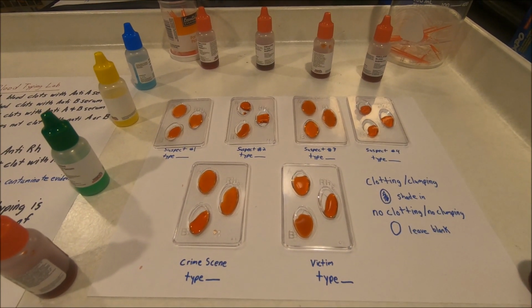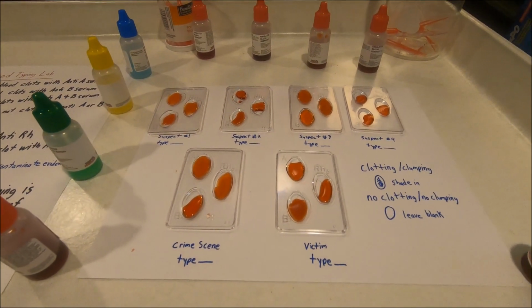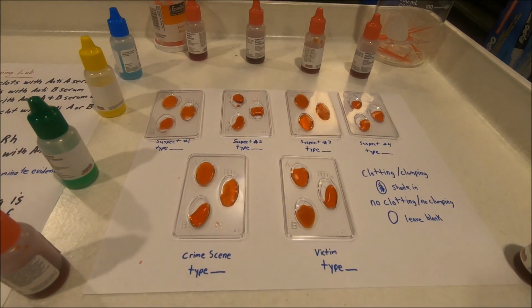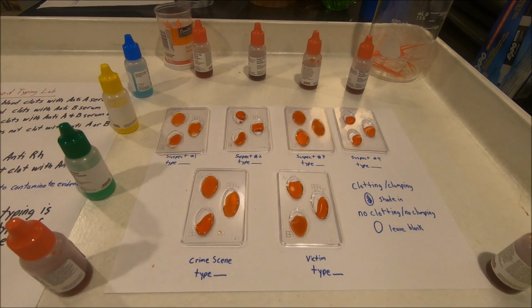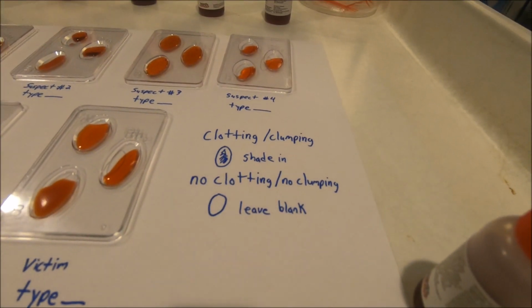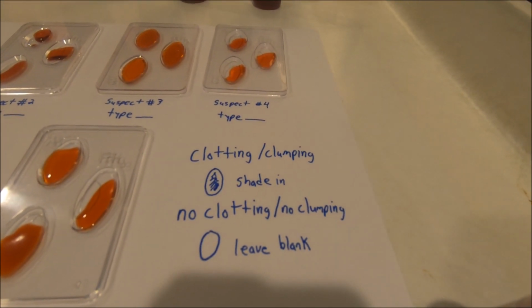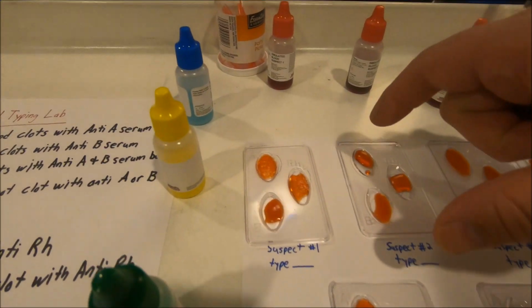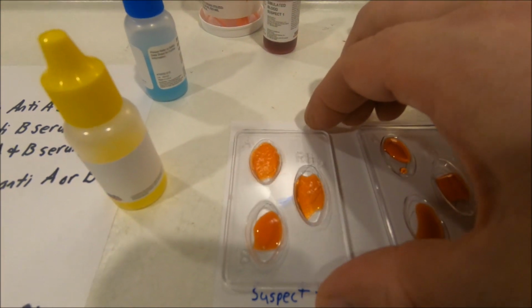All right. So now we've mixed all of the suspect, crime scene, and victim blood samples together and waited a couple of minutes to see if we saw any clotting or any changes inside each of the solutions. To begin with, if there's clotting or clumping, any kind of chunks forming, we're going to shade in the circle. If there's no clotting or clumping, we're going to leave it blank.